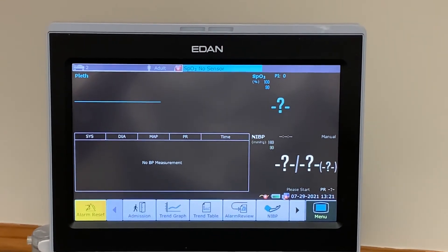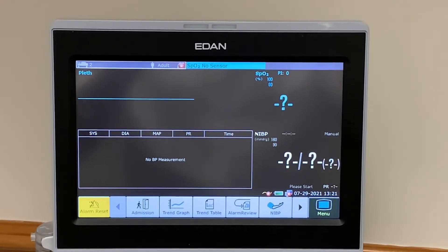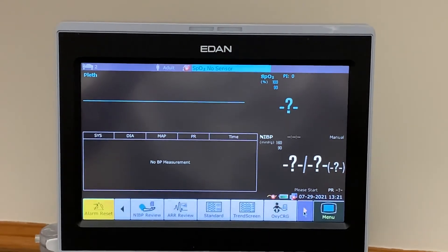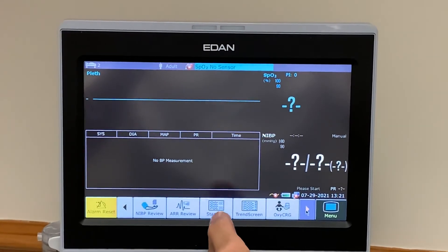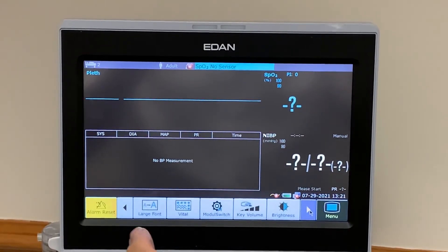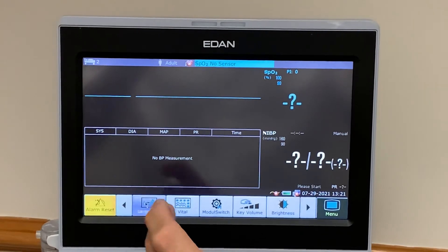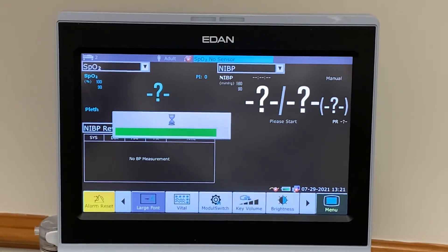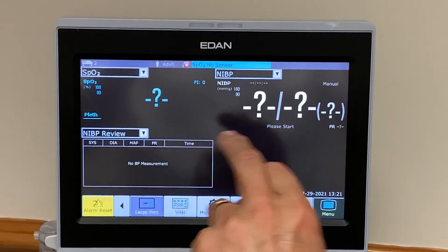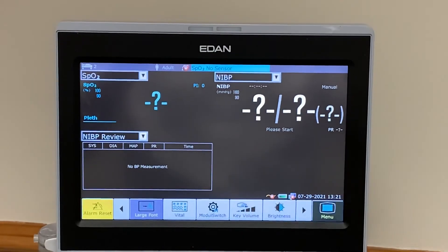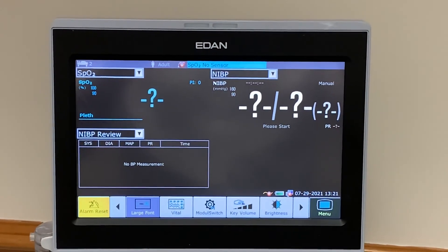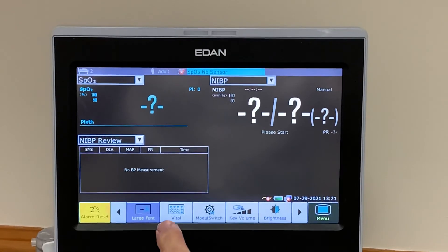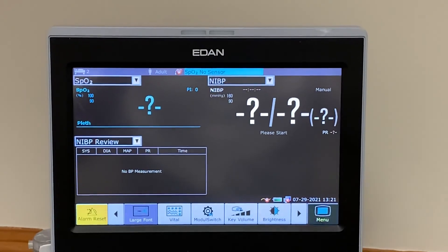At this point, the screen can be reconfigured from the waveforms view to large font, in which case we have SPO2, NIBP, and NIBP trend or review. That's the end.